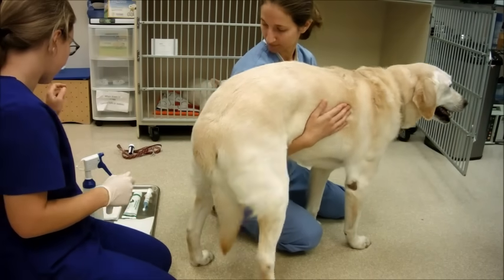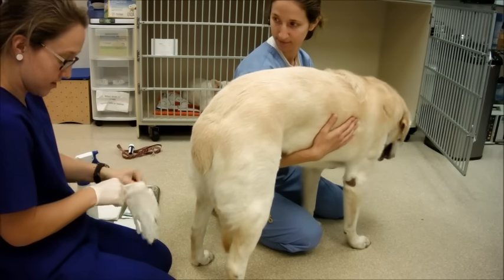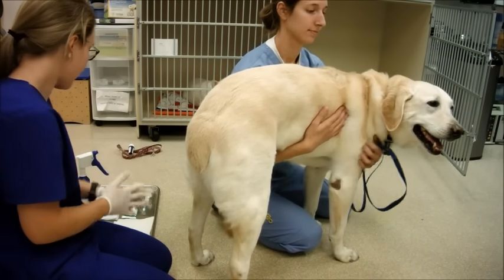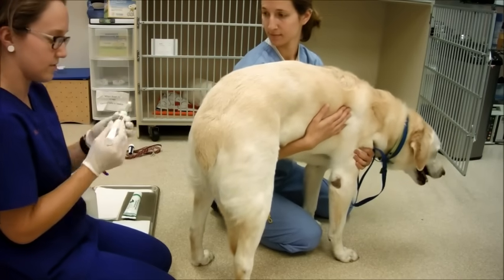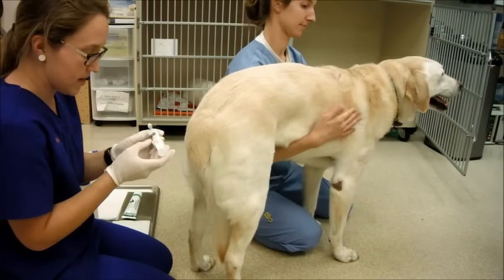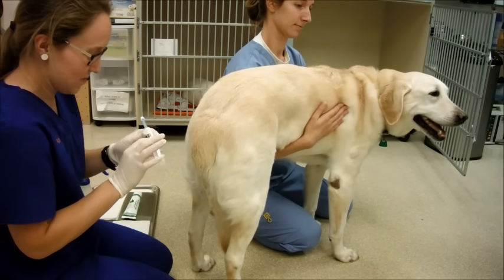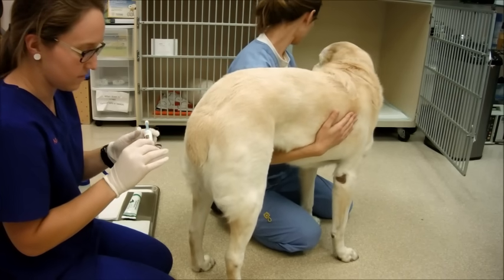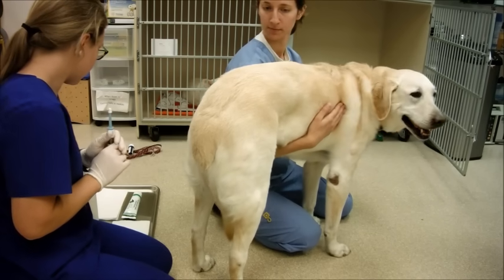I have paper towels and waterless shampoo to use once I'm finished with the simulation of the enema process, to clean up the area back there. I have some lube that I'll use on a paper towel, and then I have my enema solution. This is a pre-made enema solution — I will give this whole tube to him. It's diactyl sodium sulfosuccinate, a 12 milliliter solution with 250 milligrams of the diactyl sodium sulfosuccinate in it. That's my solution.